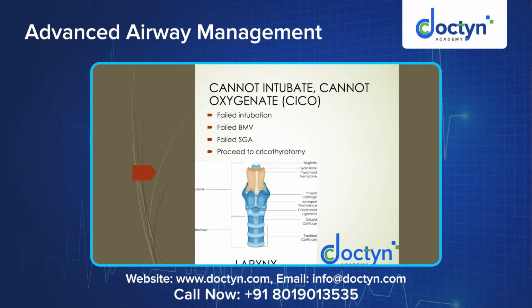Imagine there's a patient who was unconscious. You have decided to intubate the patient. You have initiated bag mask ventilation. You have maintained the ventilation well for 3 to 4 minutes. All the equipment required for intubation has been arranged. Now you have given rocuronium, and then the patient is relaxed. Now we have put the laryngoscope inside. You've got a nice vision of the vocal cords.